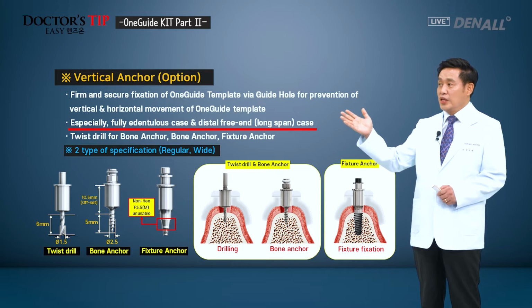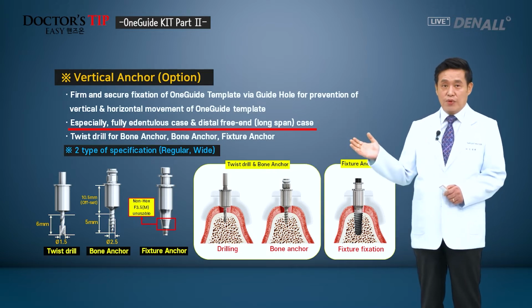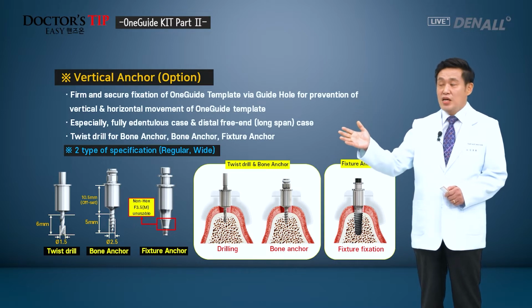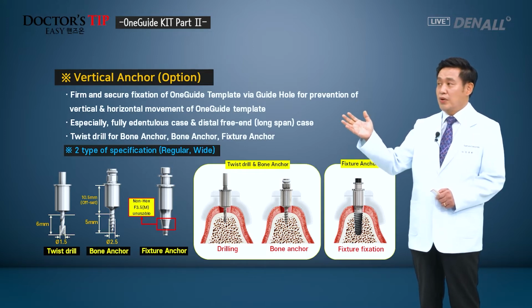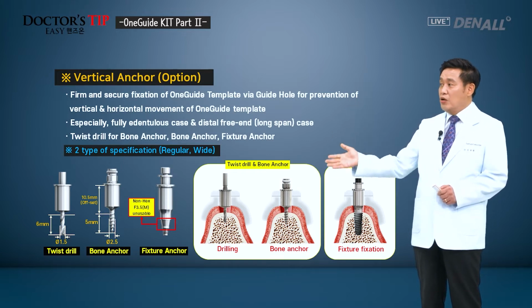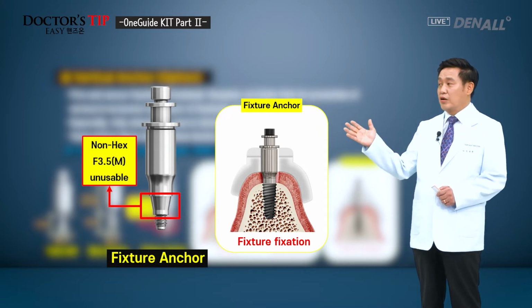In these cases, especially for fully edentulous case, and when there is long span free end on distally, you'll be able to accurately and firmly fixate the template and use it. Use vertical anchor, and if you use lateral anchor system, you'll be able to accurately position the surgical template. After removing the bone anchor system, place the fixture and connect the anchor. Using fixture, you can get vertical anchorage as well.